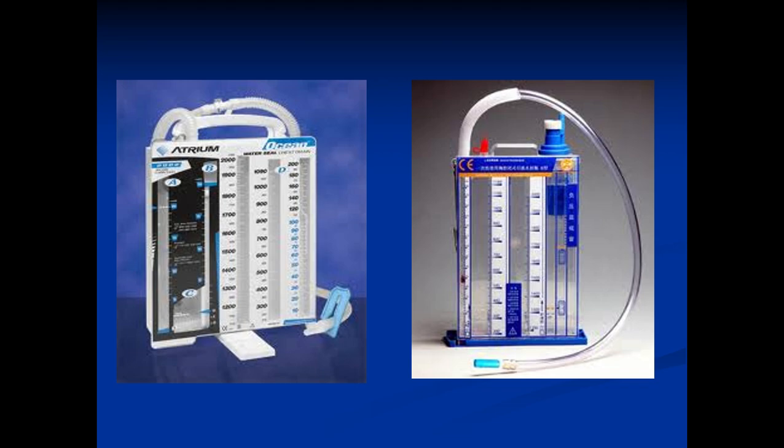The chest tube is connected to the underwater seal, which is called the atrium. This one has many chambers scaled like this, so we can detect the amount of drainage here, then here, and there is a chamber for water, colored water. So this is the underwater seal. If we want to do suction on the chest tube, we can adjust the level of suction from here.